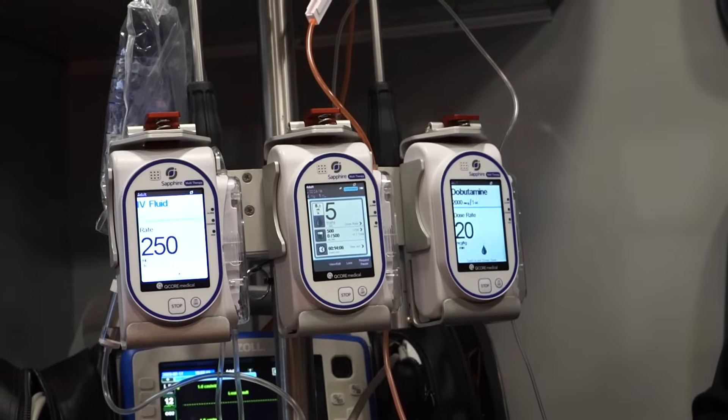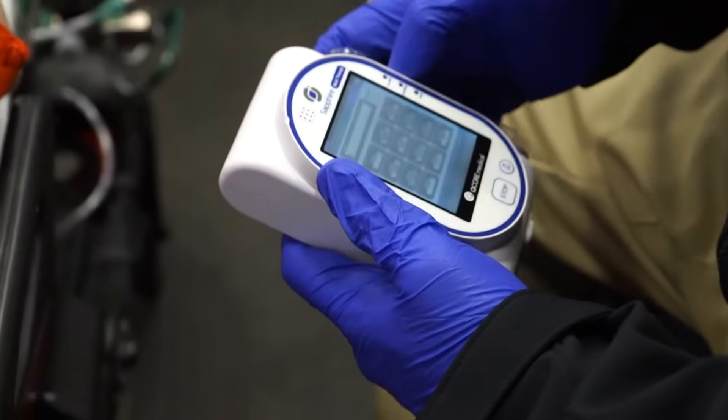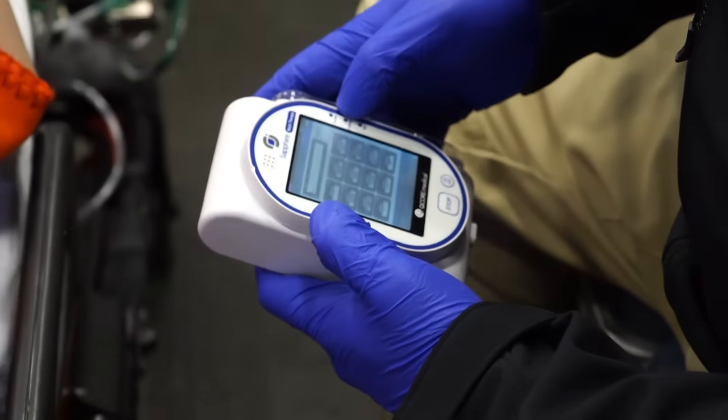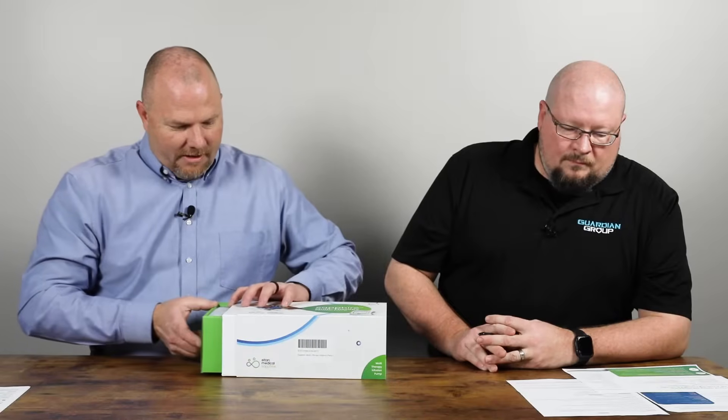One of the high points of the Sapphire pump is the accuracy — it's plus or minus 2.5%, with the industry standard being plus or minus 5%. That was a huge thing to me when I heard how accurate the pump was.